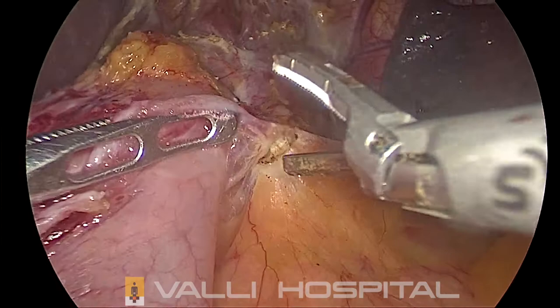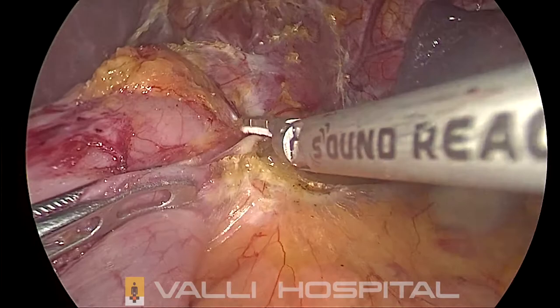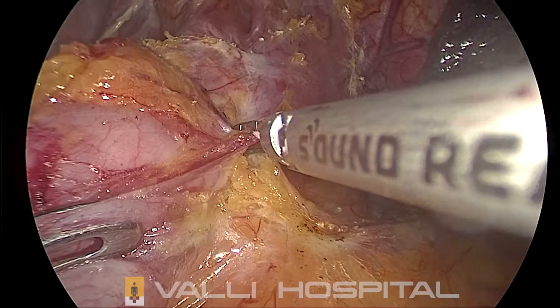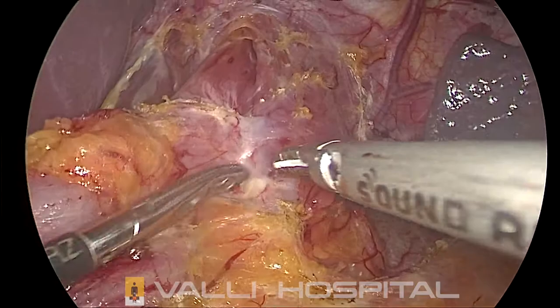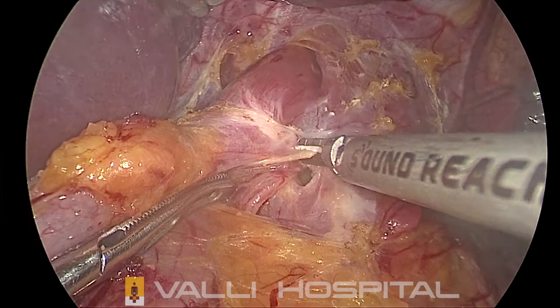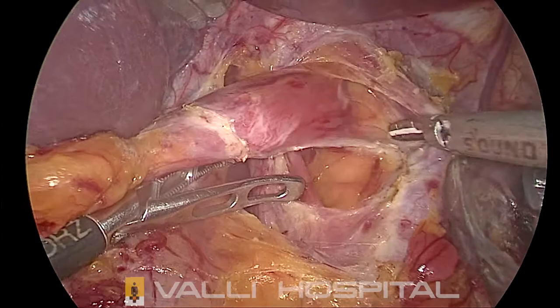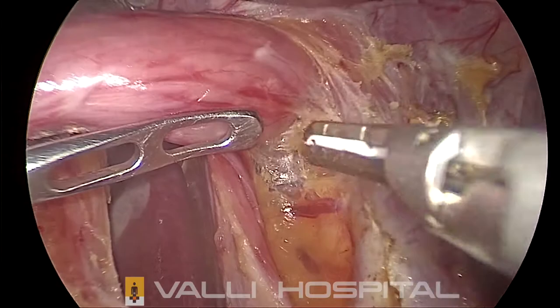Now I am dividing the posterior attachments, pancreatogastric fold. This is close to the crus. Now the crus is coming into view. That's the cleavage. Then do the sharp dissection. Once you know the cleavage, you can do the sharp dissection. With the left hand, you have to move the esophagus to the right. Here again, you have to be careful about the anterior vagus and the pleura.